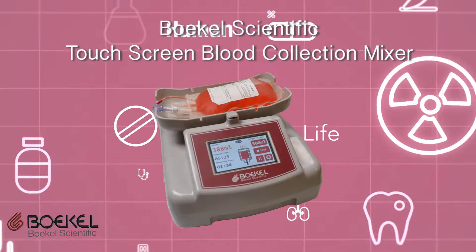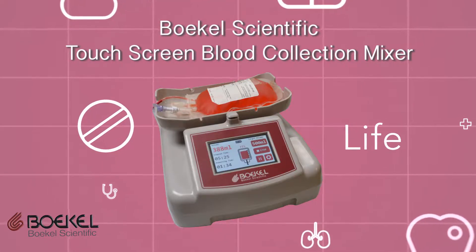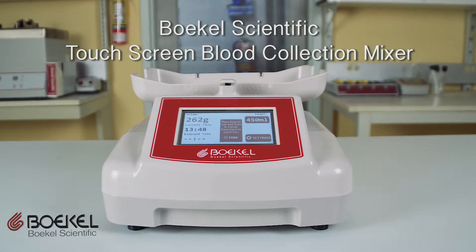Introducing the new Bogle Scientific Touchscreen Blood Collection Mixer — a blood collection mixer with the functionality and practicality for the busiest mobile and fixed donor stations. The unit can also be used for therapeutic blood draws as well.